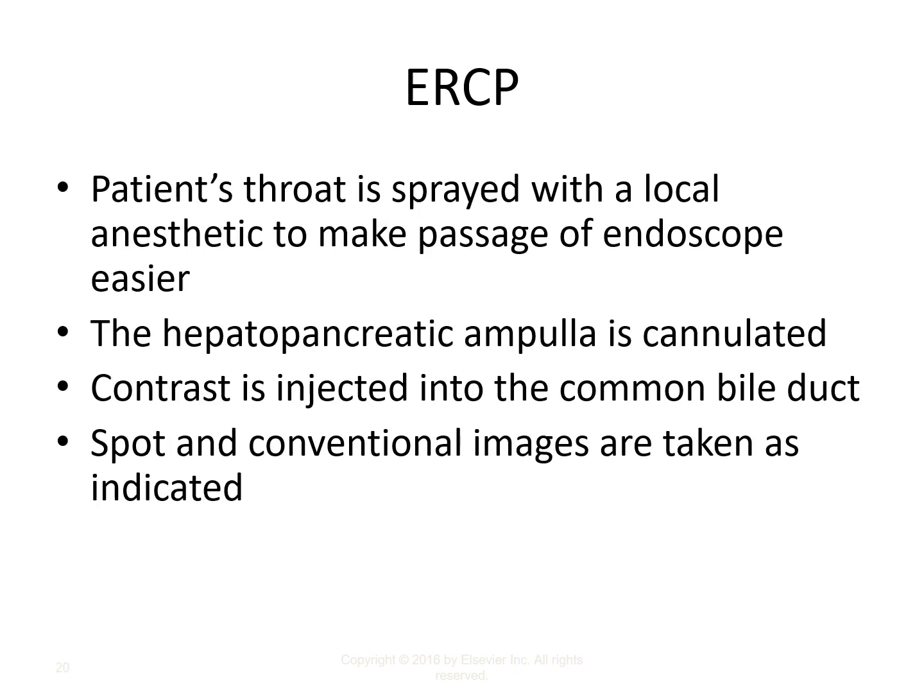The patient's throat is sprayed with local anesthetic. Again, you're not going to be passing the endoscope. You're going to be running the fluoroscope to assist the gastroenterologist in the steering of the endoscope to get to the hepatic pancreatic ampulla and to cannulate and inject contrast.